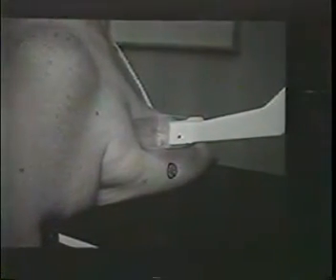with a compression device placed over the skin that has an open window with an alphanumeric grid or a hole plate, either method, a compression plate with multiple holes. An image is taken to verify the location of the calcifications. With the compression device still on, the image is reviewed, the location of the calcification is determined, and a BB is placed exactly at the site that the calcifications are at. So it lies right over the calcifications on this view.